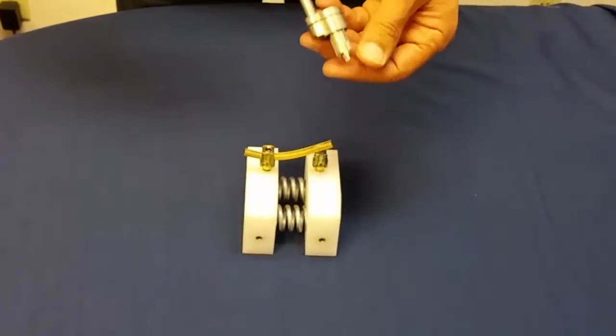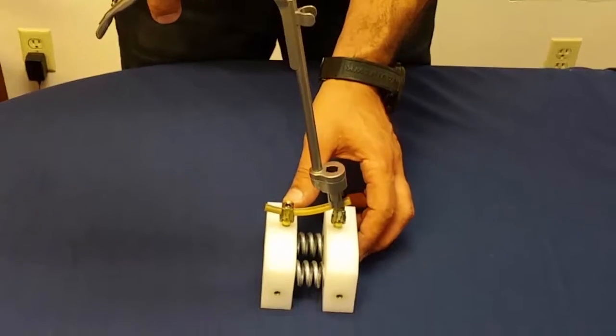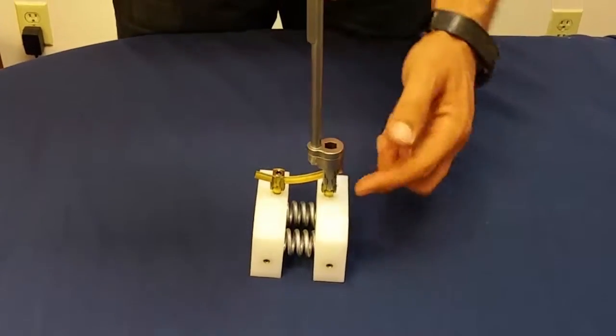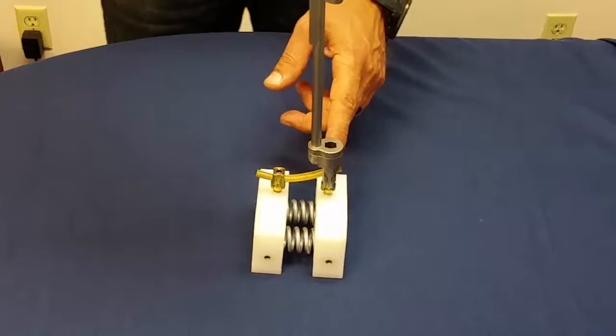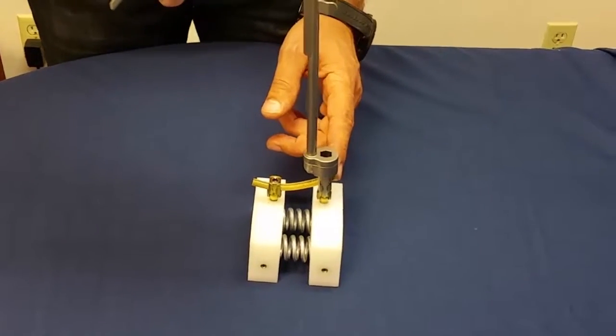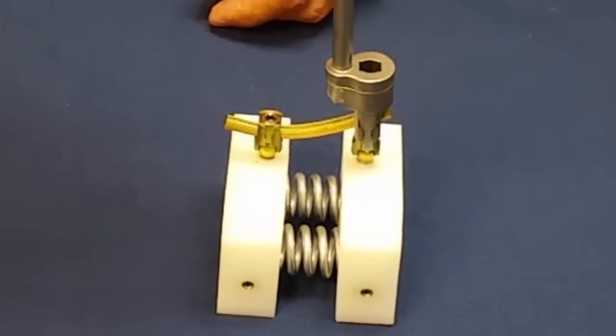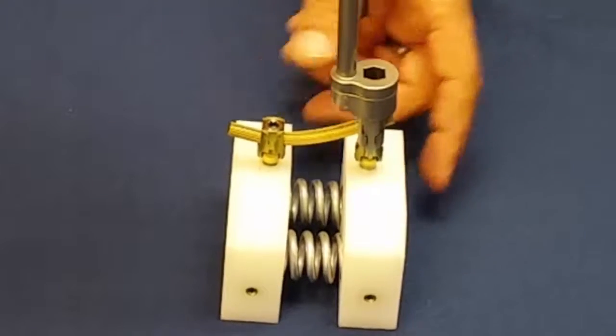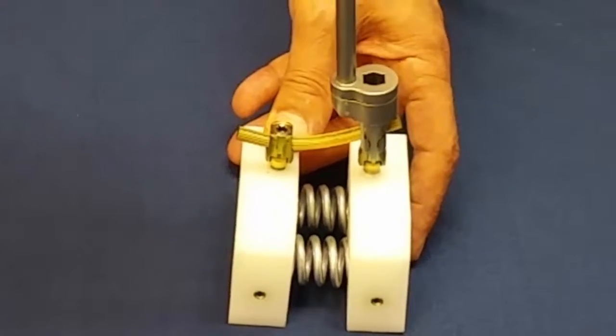This instrument has two prongs that will slide in two tracks on the receiver element and because of the extent of rod that is shown beyond the screw here or the receiver element we are going to tilt back to ensure that sufficient rod is present in front of the reduction instrument.